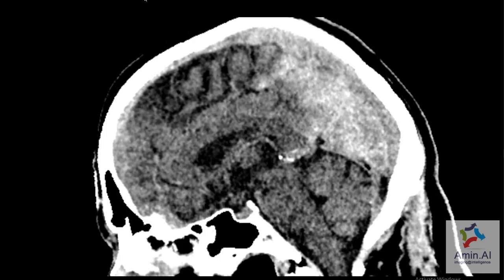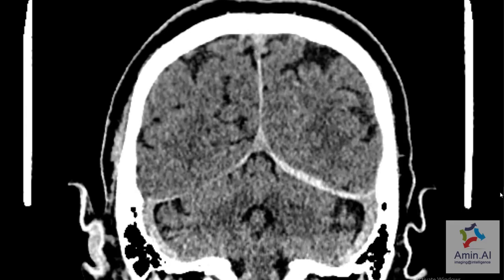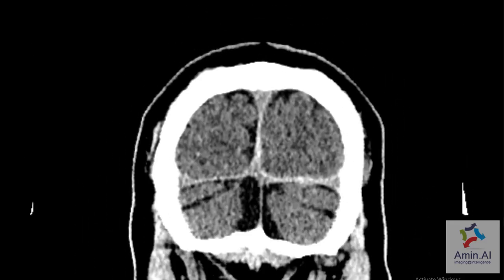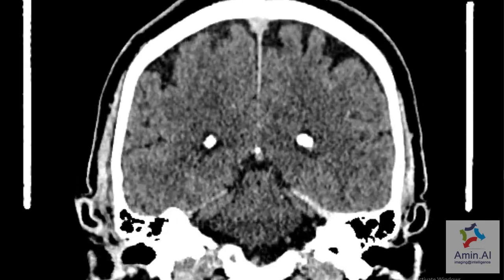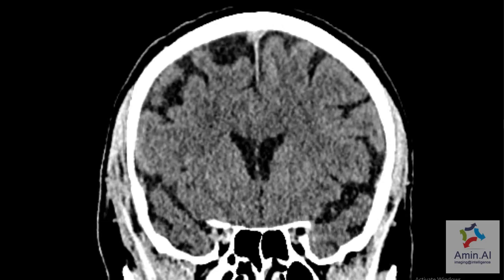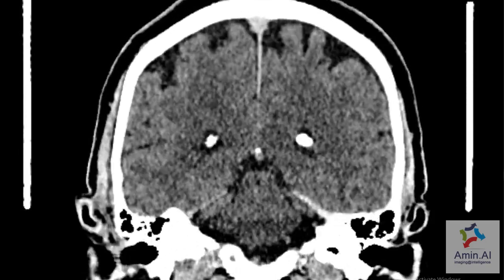And if I do a coronal view, what you will appreciate is that this hyperdensity is present along the left leaf of Tentorium and extending into the left subdural region. So this is a case of subdural hematoma.